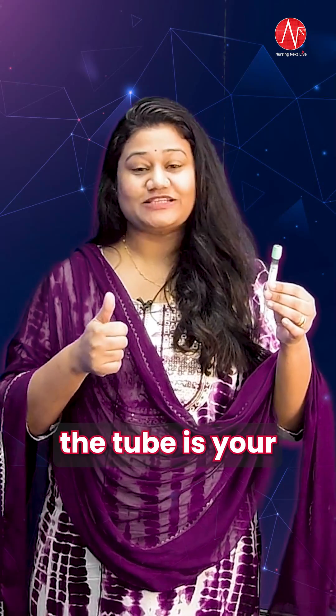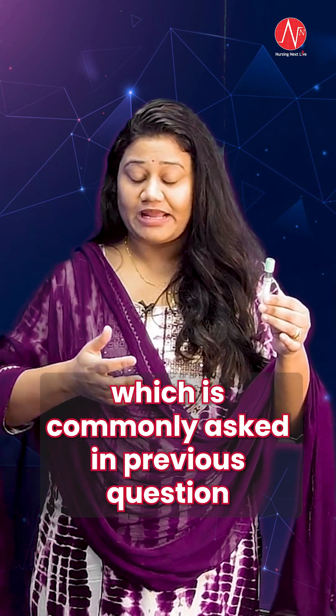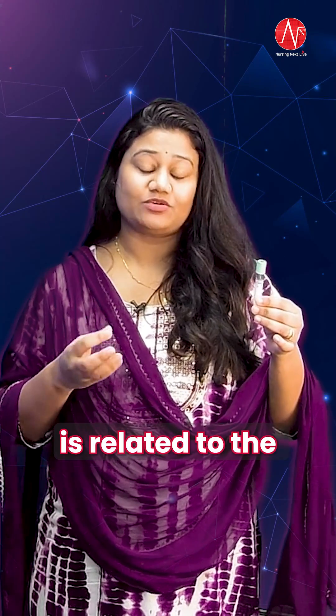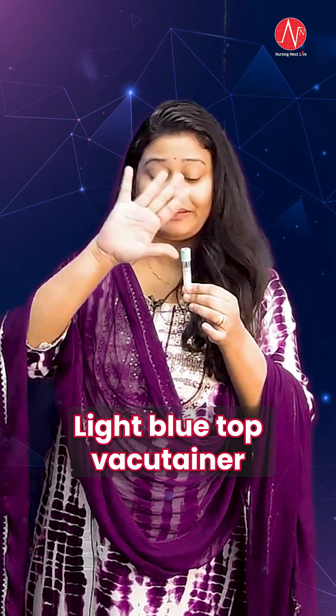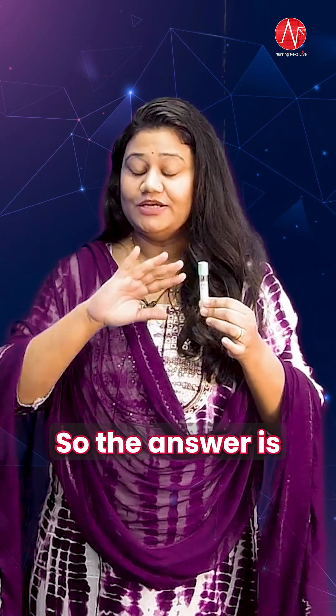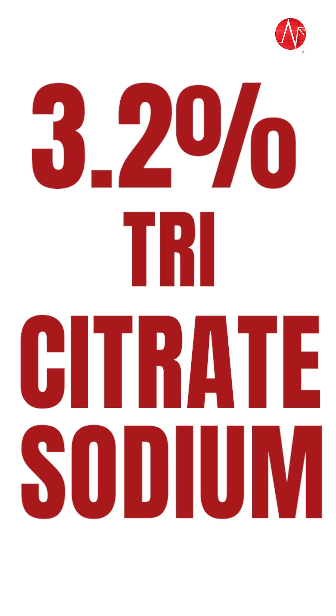First, the tube is your citrate tube. The second point, which is commonly asked in previous year questions, is related to the anticoagulant. Which anticoagulant is present in this blue top, light blue top vacu-tainer? The answer is 3.2% trisodium citrate.